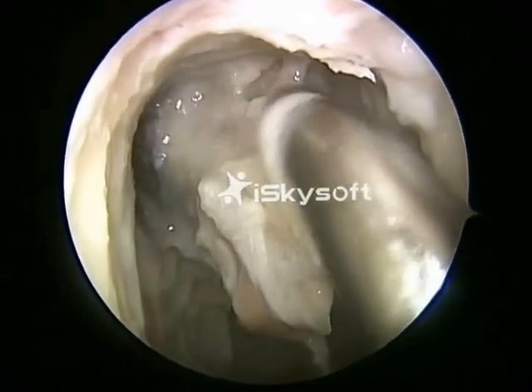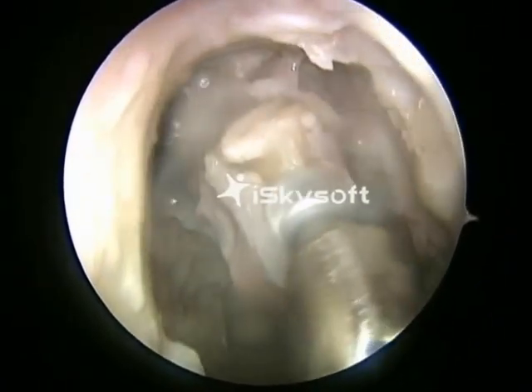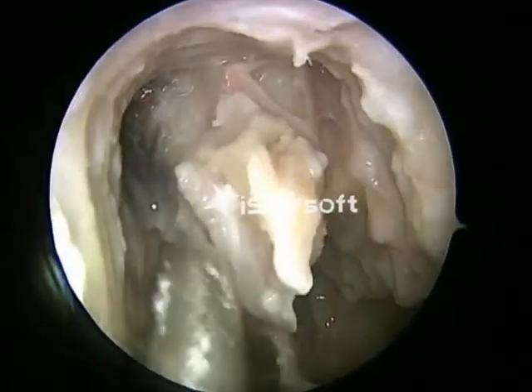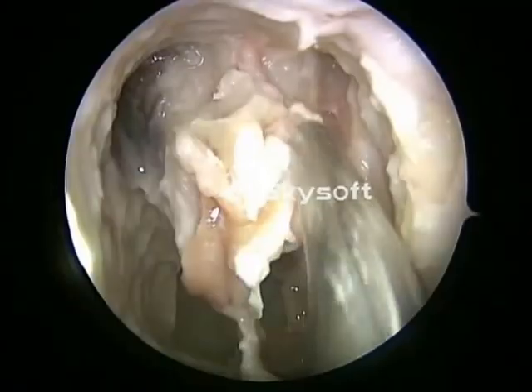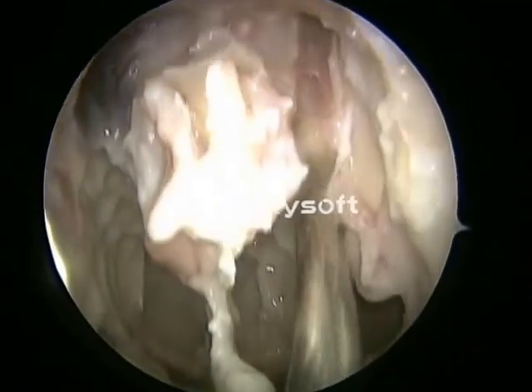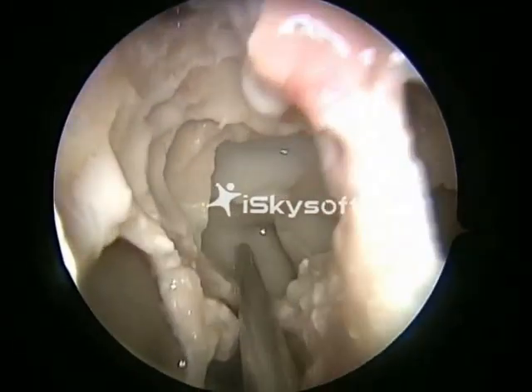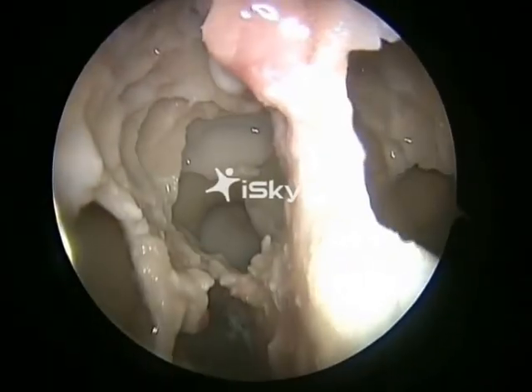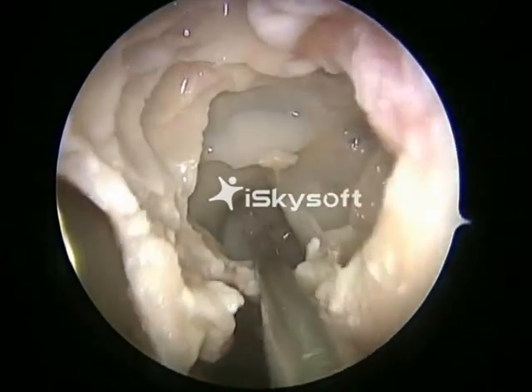Extreme caution should be exercised when we reduce the frontal T because we may enter into the skull base if we are very rash during this step. Tumors that don't involve the posterior table of the frontal sinus and just posterior to it need not have a Draf 3 procedure.